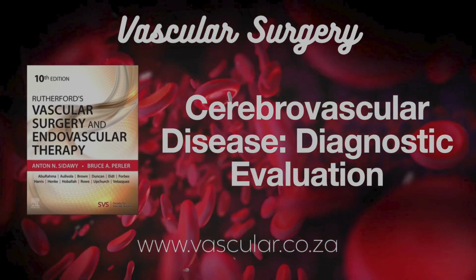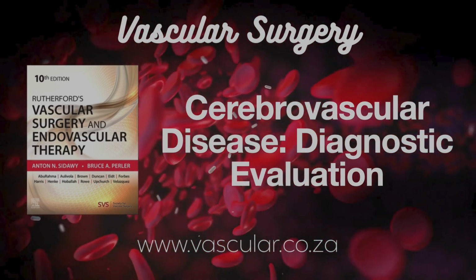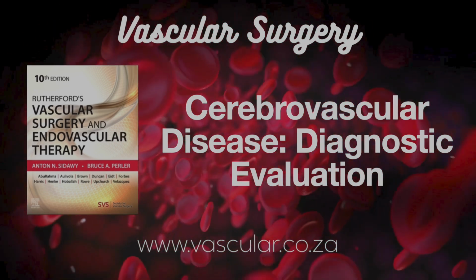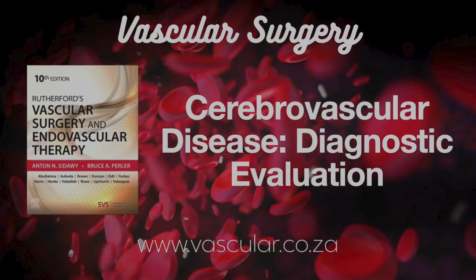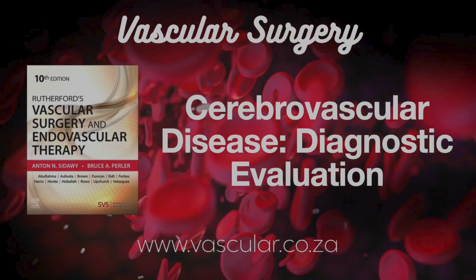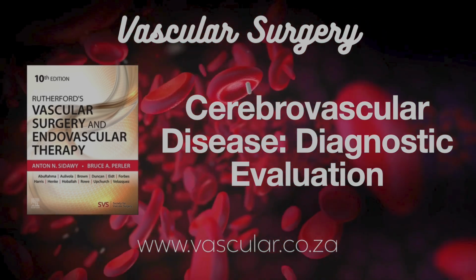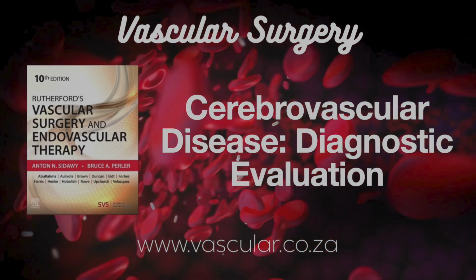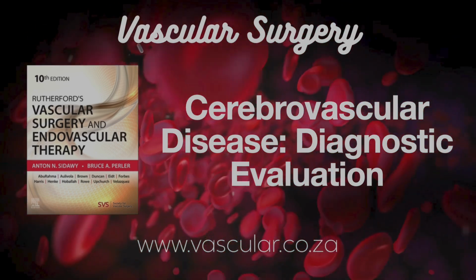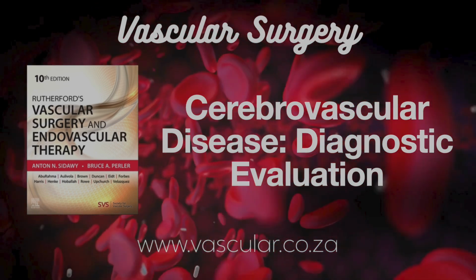For stent patients, the follow-up is similar: DU at 1 month, then maybe every 1 to 2 years, but using those adjusted velocity criteria specific for stents. Again, if stenosis looks significant, 80% or maybe 50% if they have symptoms again, further imaging and potential reintervention follow. So DU is the main tool for surveillance, with CTA stepping in if problems arise.